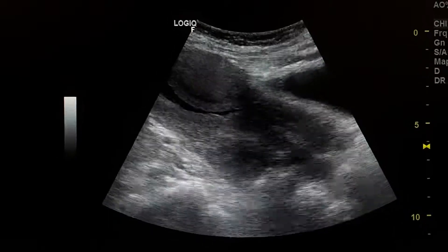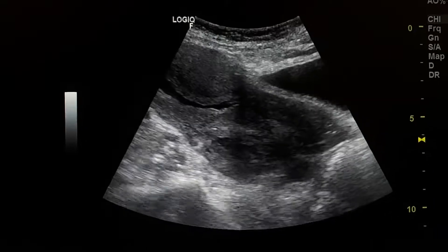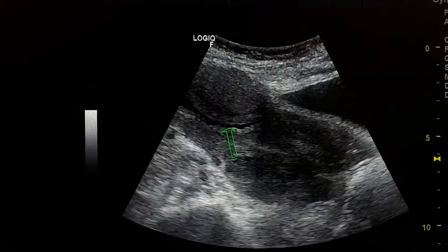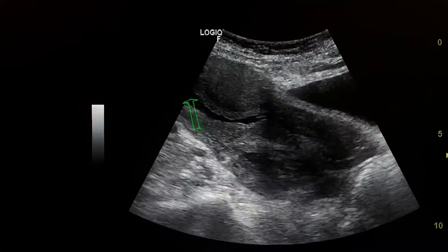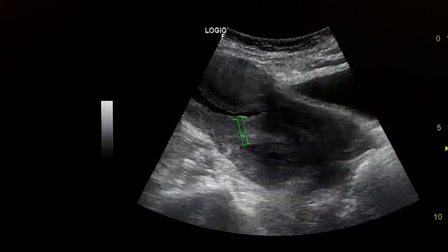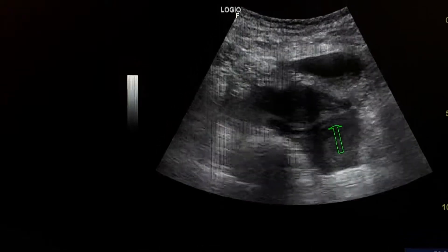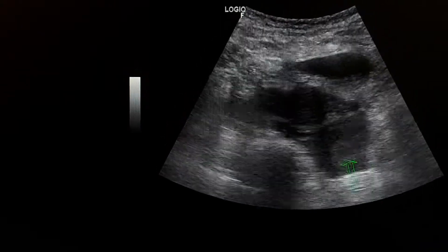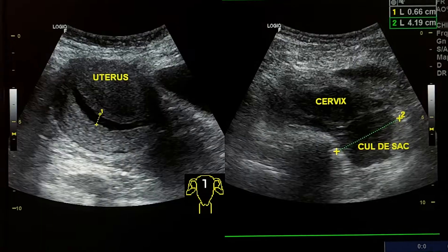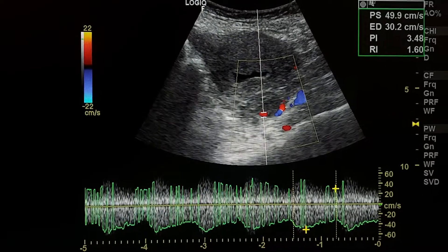This is a female with a positive pregnancy test and lower abdominal pain. The fluid inside the uterus was misinterpreted by the obstetrician as a gestational sac. Here in the cul-de-sac, we see a ring lesion with blood flow.